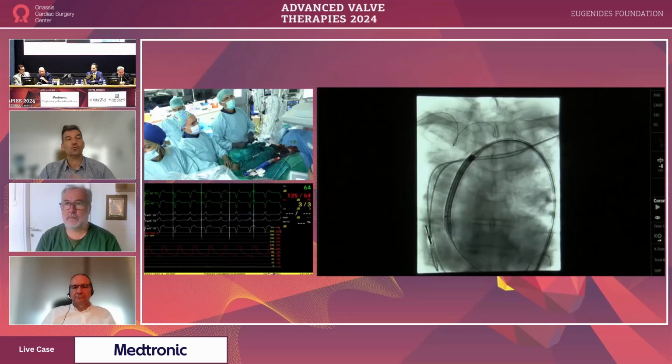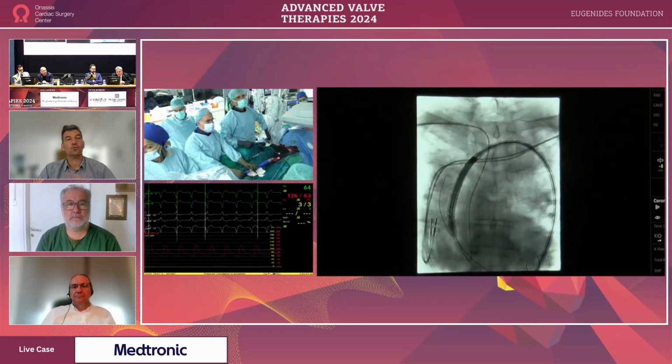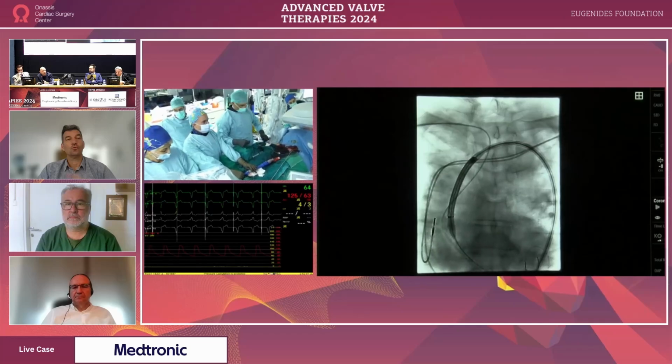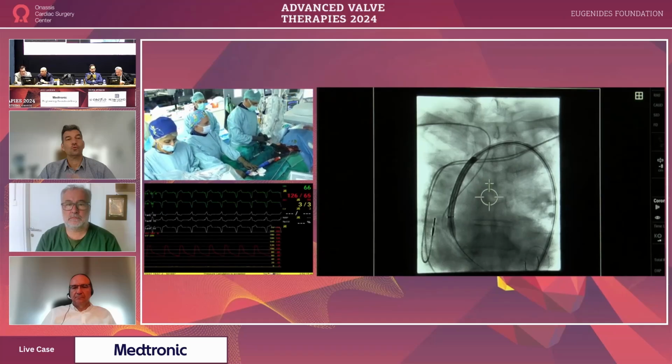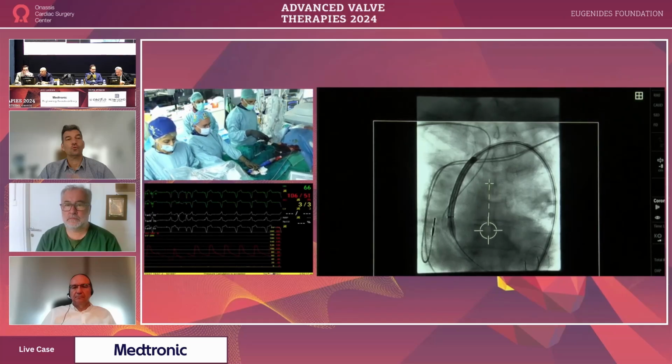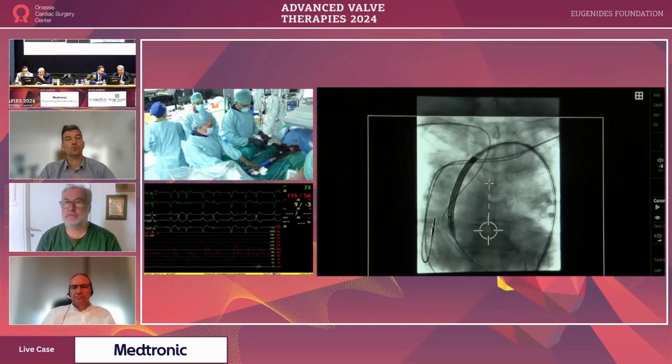Look, I said from the beginning, if you remember, it's a challenging one. It's like implanting in a pure AI case. You see no calcium, no stability. It is jumping, and I think we should just let Ioannis work. He's experienced enough, and he'll do the job.